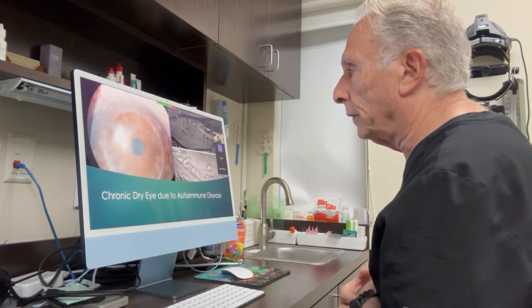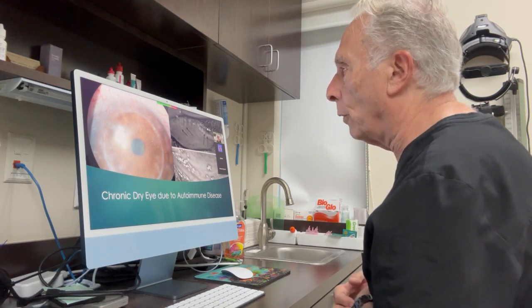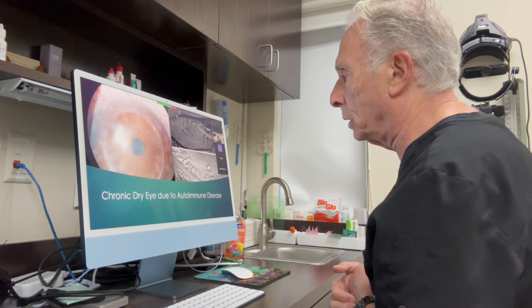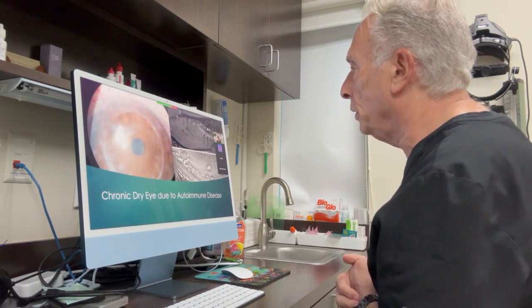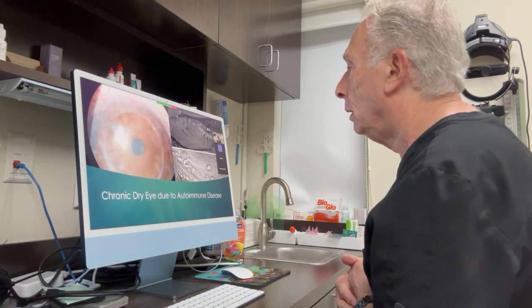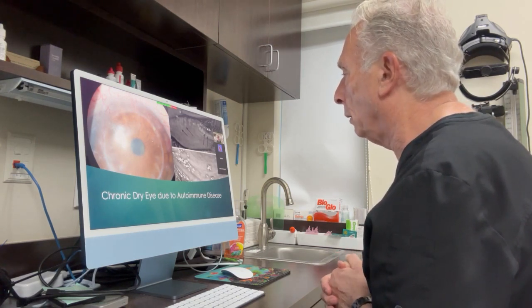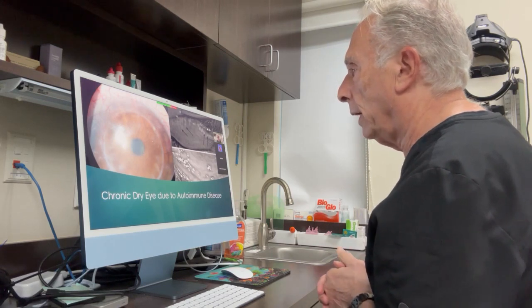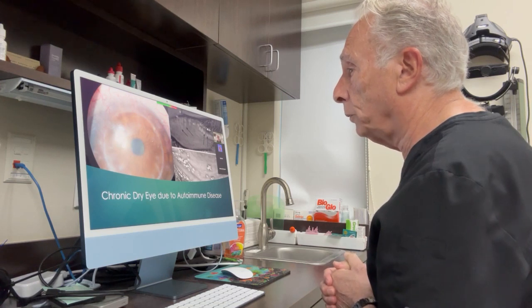This is a photo of a transplanted cornea over an eye, autoimmune disease. This patient has lupus. And you can see virtually no meibomian glands. The arrows are pointing to a little bit of pieces of the meibomian gland, upper lid and lower lid. And we fit this eye with a scleral lens, and the patient has fairly good vision.